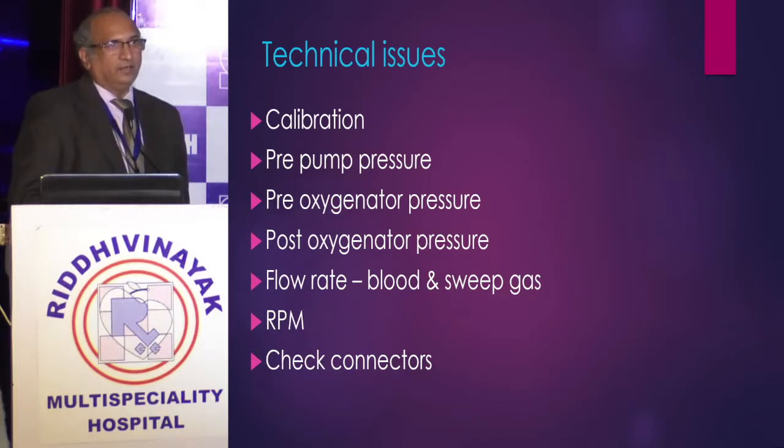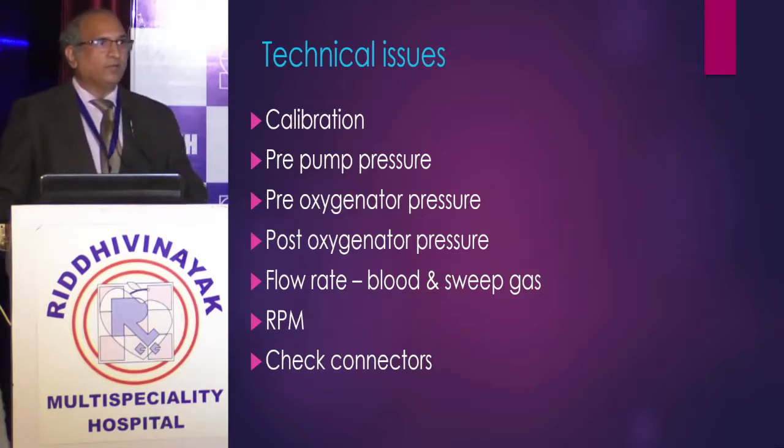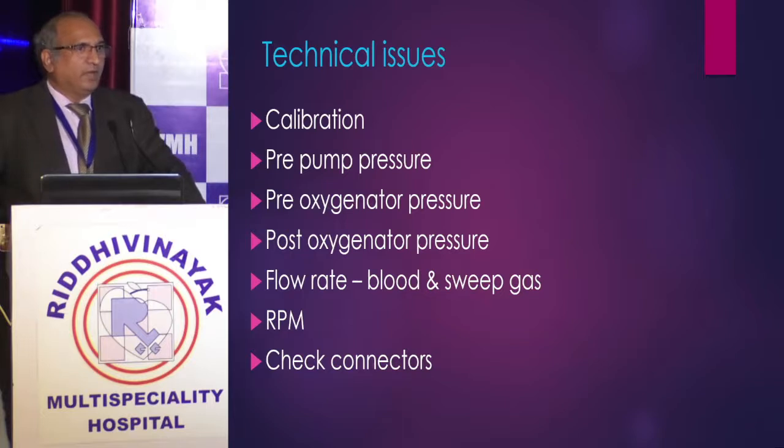And they are life threatening. When the patient is on ECMO, most of the support is basically from ECMO. So even if there are some patient related complications, like the lung worsening or parenchymal worsening, that won't be life threatening.